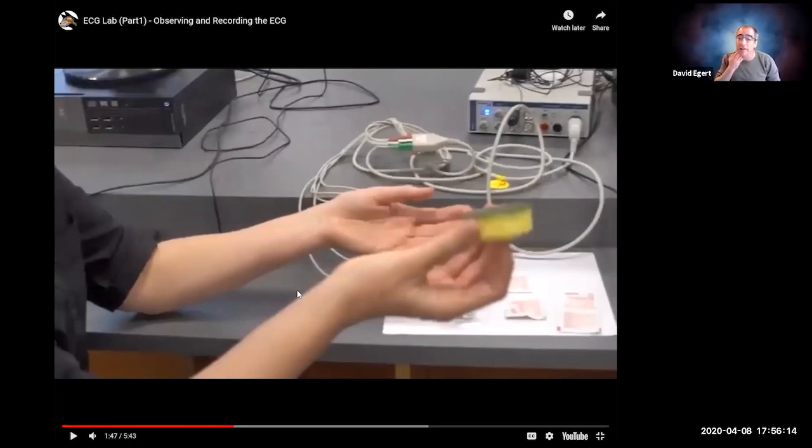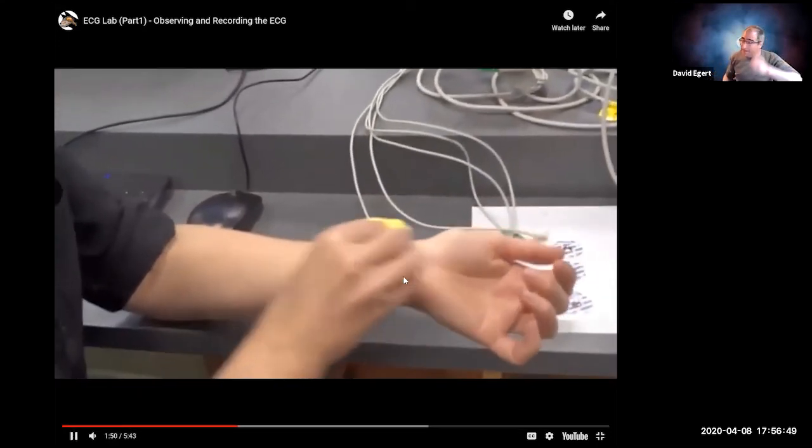So for any kind of electronics that you add on, I've mentioned this before, but I'll mention again, it's really important that the worst failure mode of this can never have the person connected to the power mains. That can be catastrophic. If you put 110 volts, 60 hertz across your arms, right across your heart, it can disrupt your heartbeat in a really bad way. So she is not risking her life by doing this here.